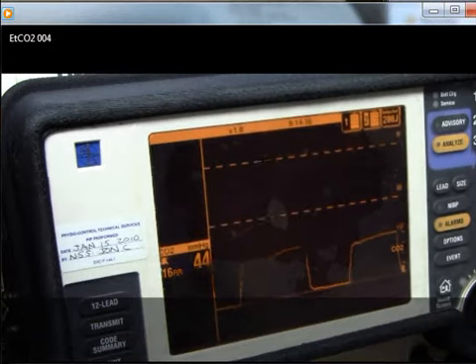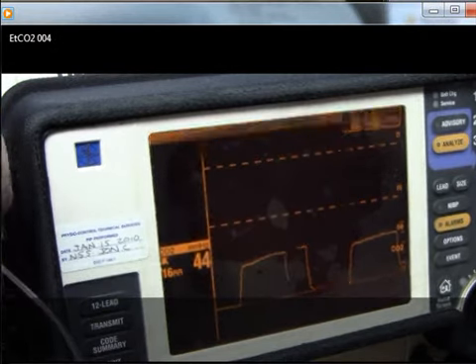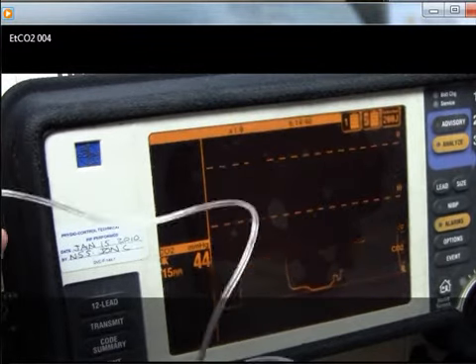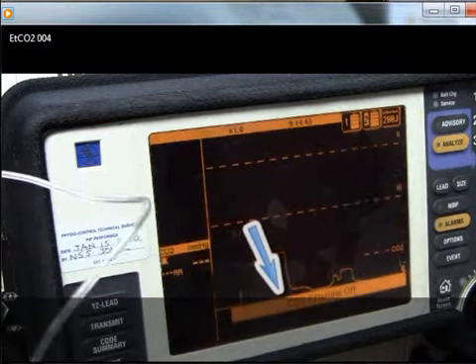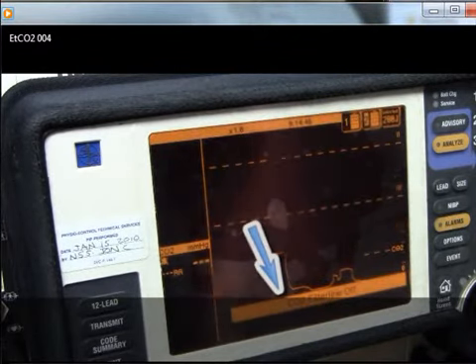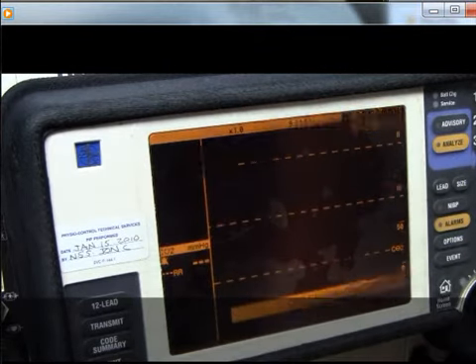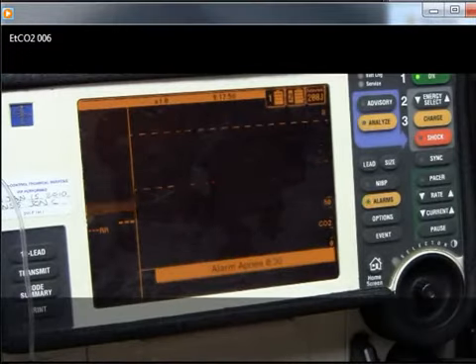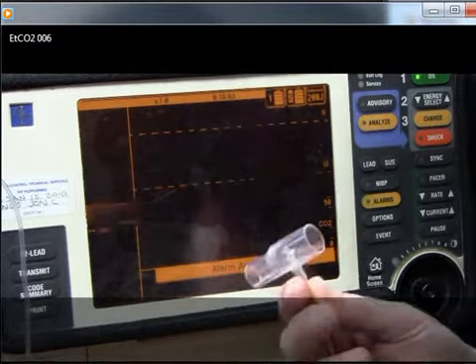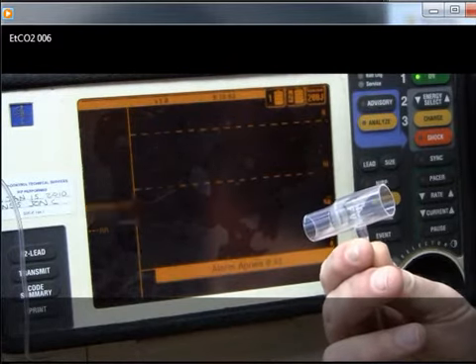We are going to continue with some troubleshooting solutions when a value or a waveform is not obtained. Here, we are going to intentionally loosen the filter line connection at the LifePak 12. Notice that the monitor identified the problem. Always check this connection to make sure it is snug. The next troubleshooting tip is to blow into the filter line if you are ever unsure that the end-tidal CO2 module is not functioning properly.